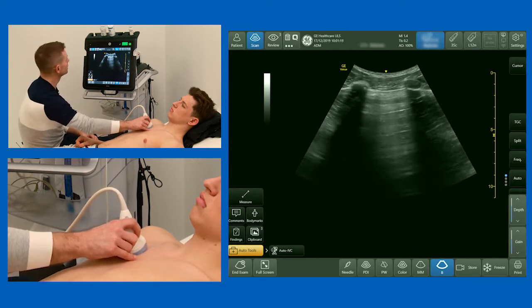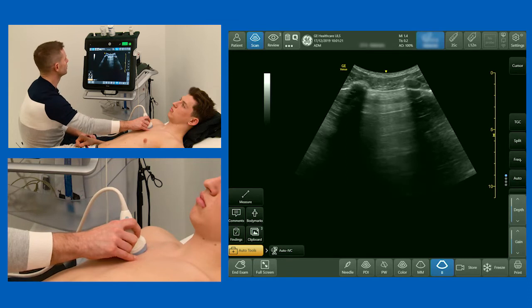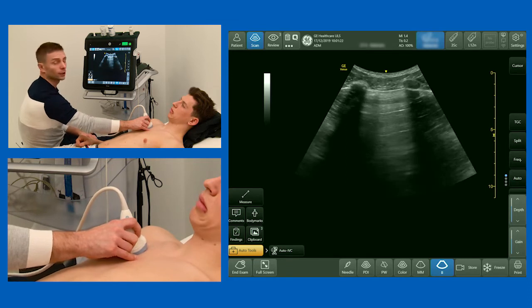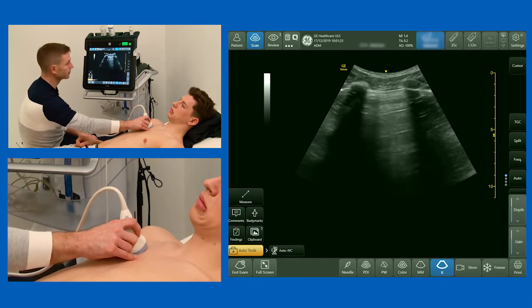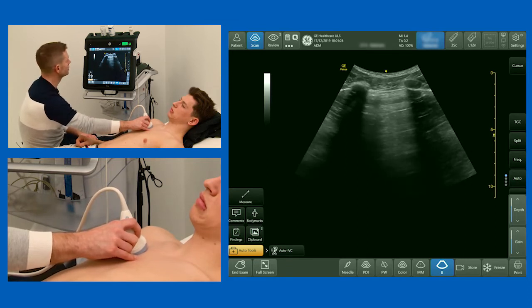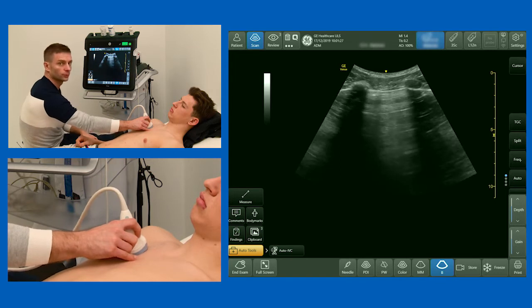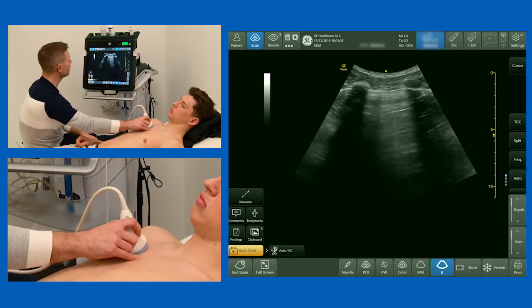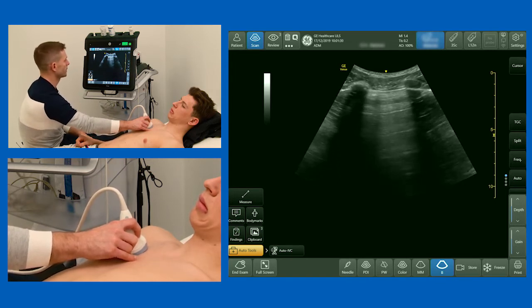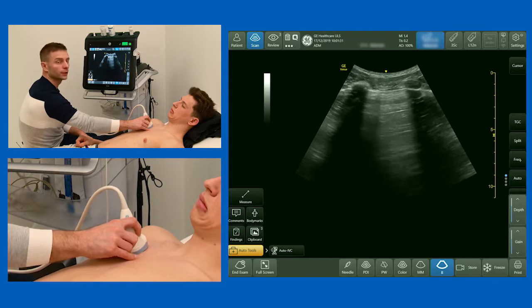The first thing I'm going to look for is something called lung sliding. There are two pleural layers — visceral and parietal pleura — that slide over one another with respiration. And the first thing we look for is this lung sliding.